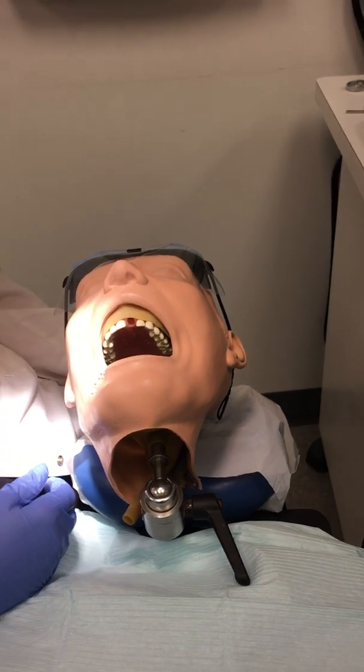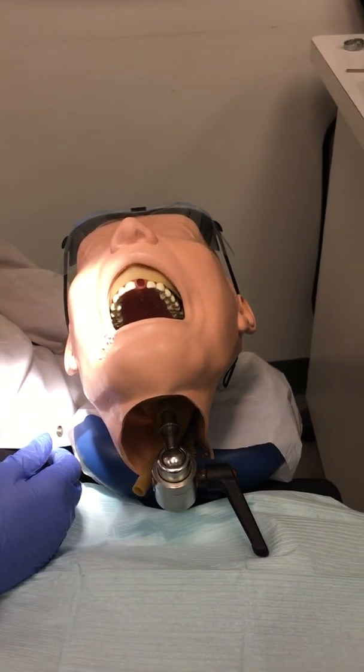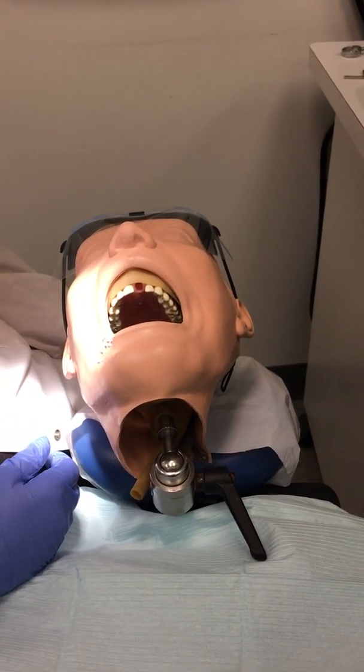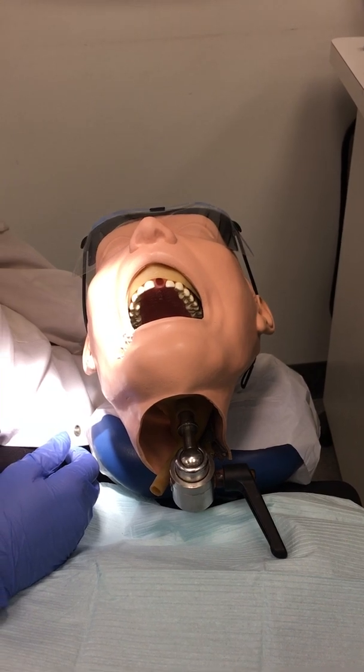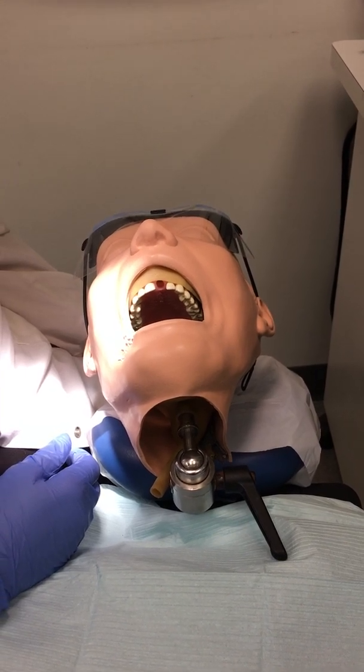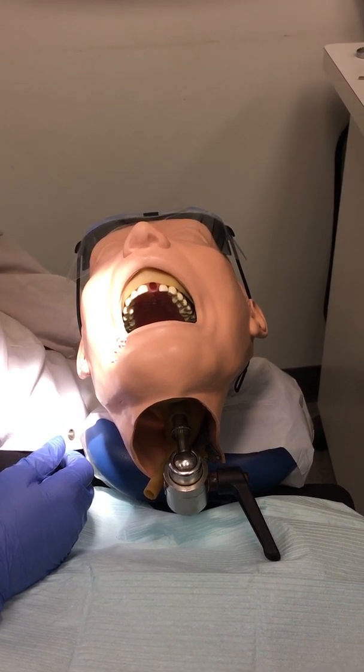We're going to do a demonstration of a root canal procedure today. The first steps are to greet, seat, and prepare a patient for the procedure.